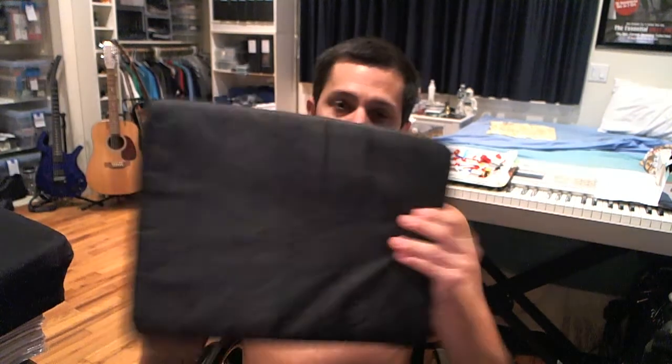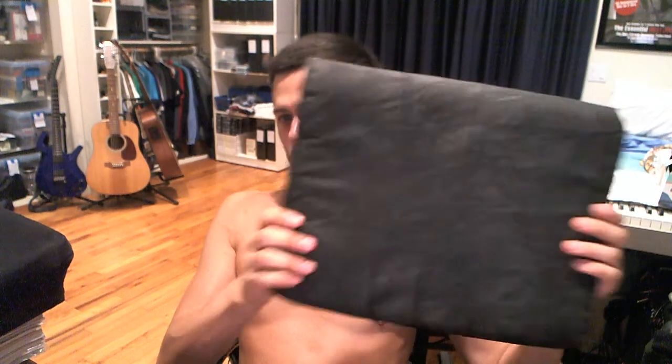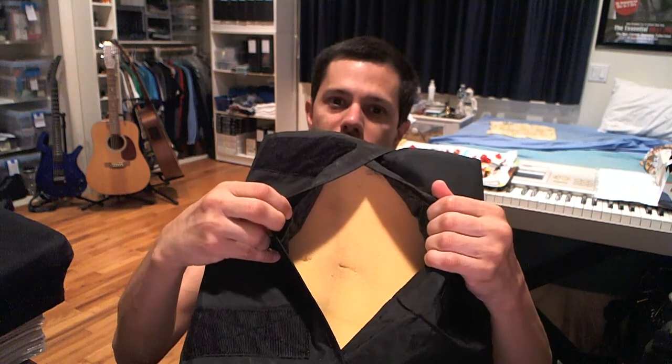So here is the original one I had. As you can see, just a regular foam cushion, rectangular — holds this way, that way. You can even see the foam on the inside. Pretty basic, bare bones, no frills.